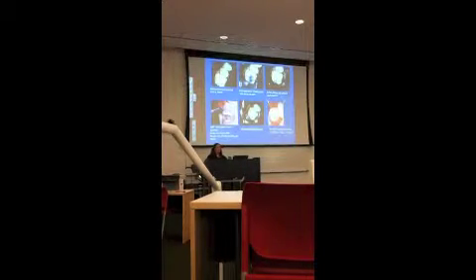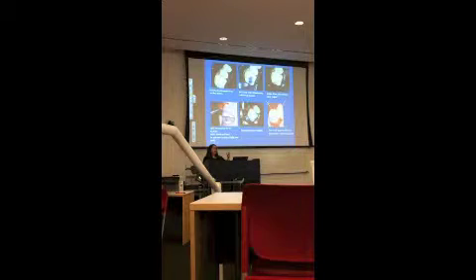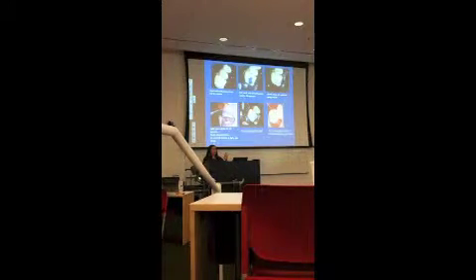I'm not sure if on your typodonts you can see the decalcification or the demineralization after the etchant. On patients, when you work on patients, it's going to look chalky white. So as you dry it, it's going to look chalky white. And that means that it's etched sufficiently and you can proceed with the procedure.